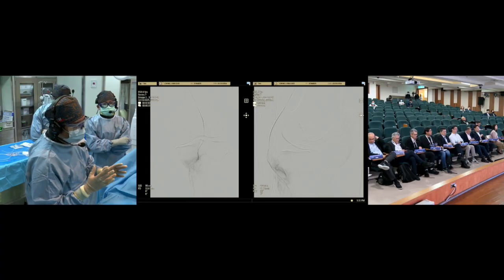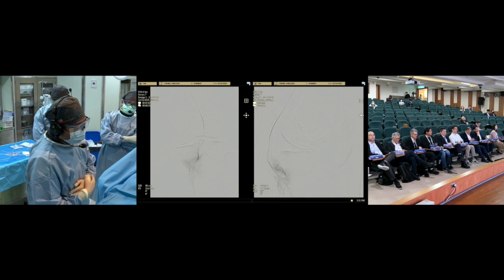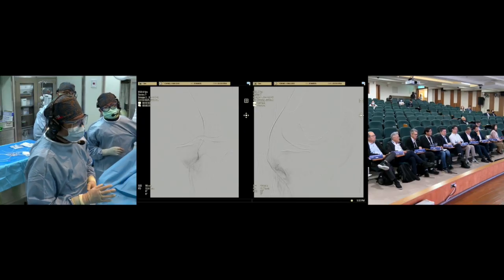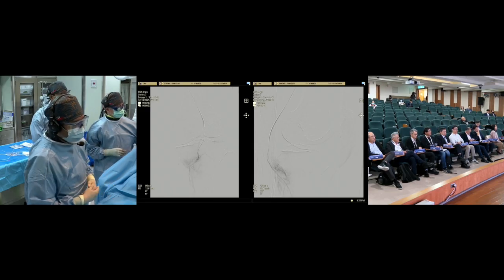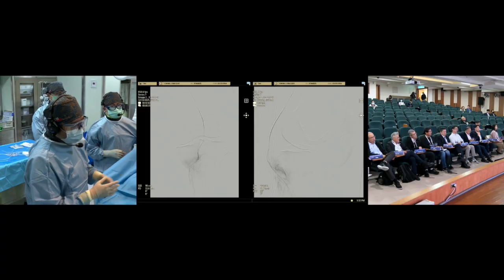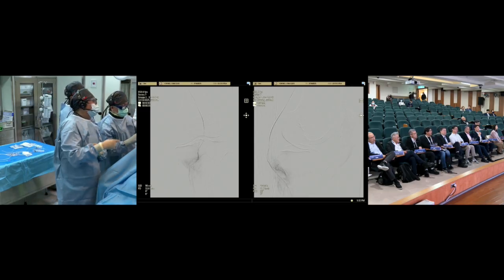For me, I will do the embolization first to stop the bad angiogenesis, and then I will combine with some regeneration injection to reboost the healing process. Because for chronic inflammation, the angiogenesis does not help you heal. It stops you from healing by the micro AV shunt, by the steal syndrome. Just like tumor angiogenesis, that is a bad angiogenesis. You should stop the bad angiogenesis and then reboost the good one. Very good.